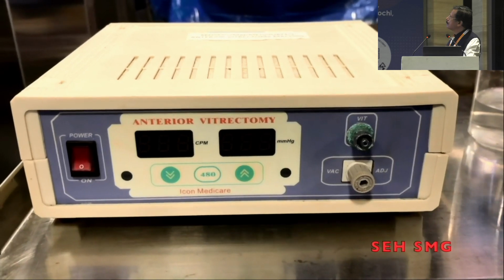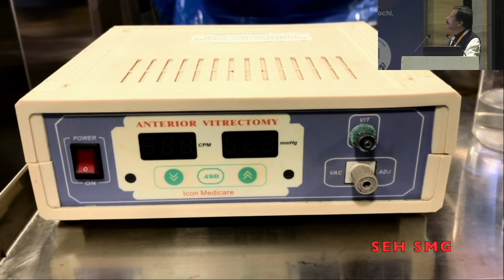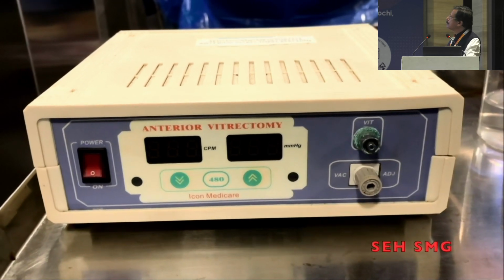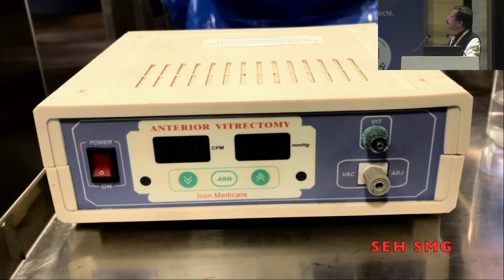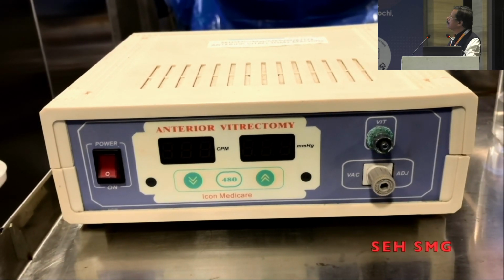This is the front view of the vitrectomy machine. It has 2 digital displays for cutting and aspiration, one knob for the vitrectomy probe, and another knob for adjustment of the vacuum, and the electrical switch. The cost is much lesser than an auto refractor. One can easily afford to buy this machine.